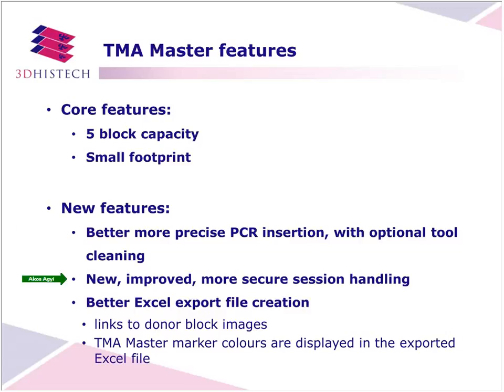We have new, improved, more secure session handling and a better export file creation. Now the links to donor block images and the color of the TMA markers are displayed in the exported XLSX file.